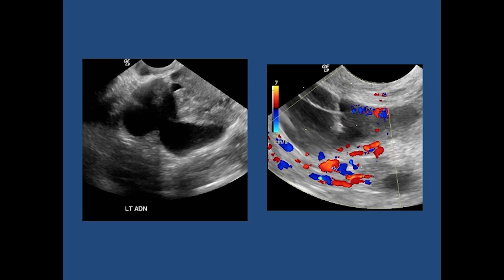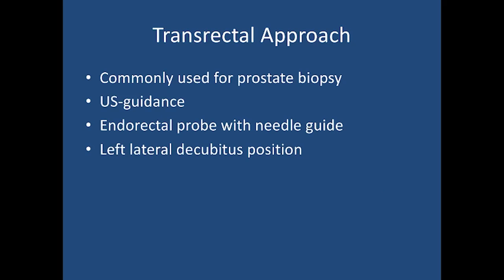And in this example, we have a patient with a large loculated left adnexal collection, and using transvaginal ultrasound guidance, we place a needle using Doppler imaging to watch for any intervening vessels to sample and decompress the fluid collection.